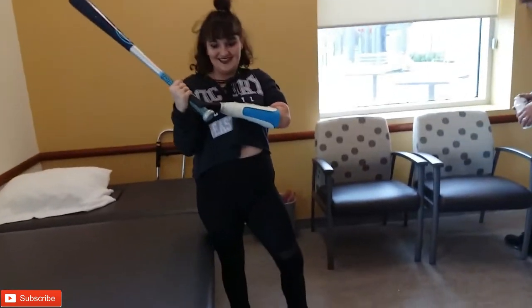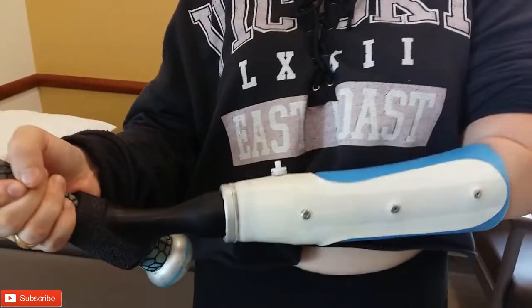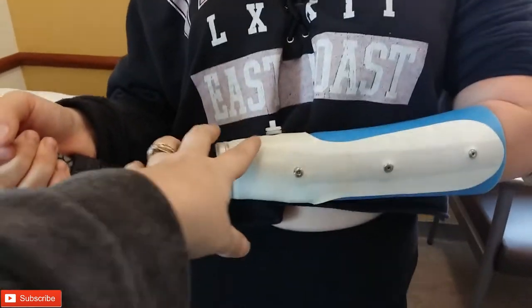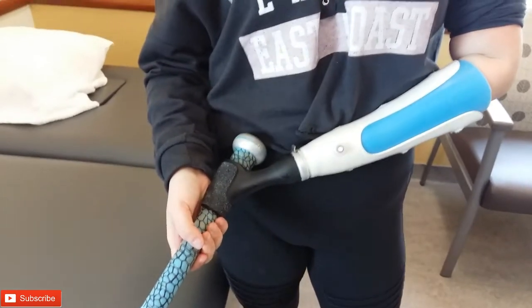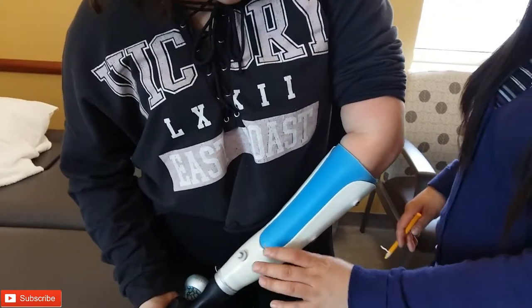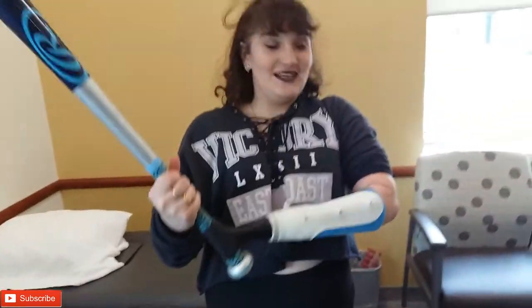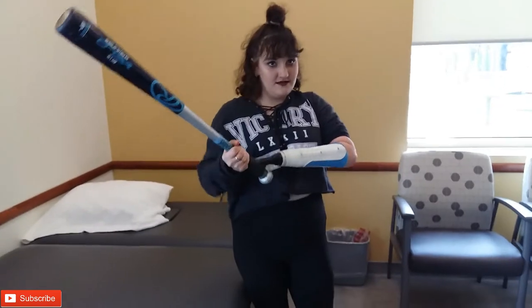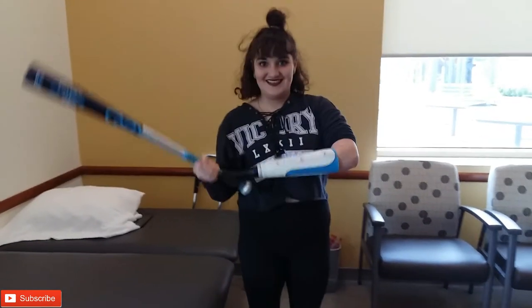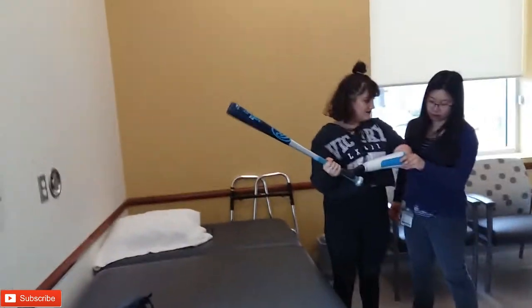I think that turned out really good, guys. I like it. Can you just get a close-up of the prosthetic? That's cool. This little button here — what does it do? Air suction. Yeah, so she can move in and out. If there was suction, she would release this button to pull the air in and pull her arm out. That's cool. What do you think? I don't need that in my arm. Yeah, you don't need that. I think it looks good. Do you like it? Yeah.